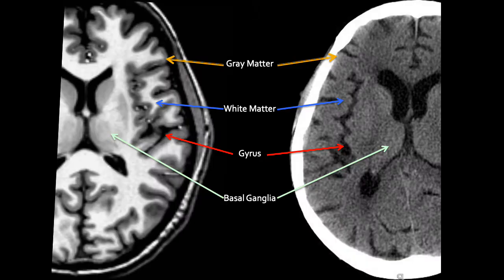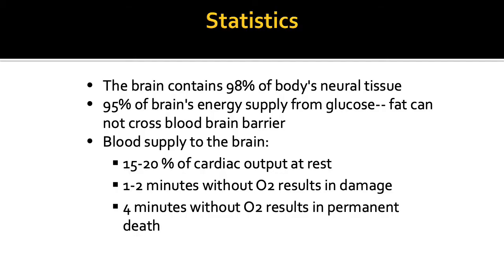If we take a look here, the image on your left is a typical T1-weighted MRI axial sequence, and at the same level with the same patient is a non-contrast axial CT image of the brain. You can see that in CT the gray matter appears white and the white matter appears gray, and the basal ganglia — which are gray matter islands — are actually white. The brain contains 98% of the body's neural tissue.